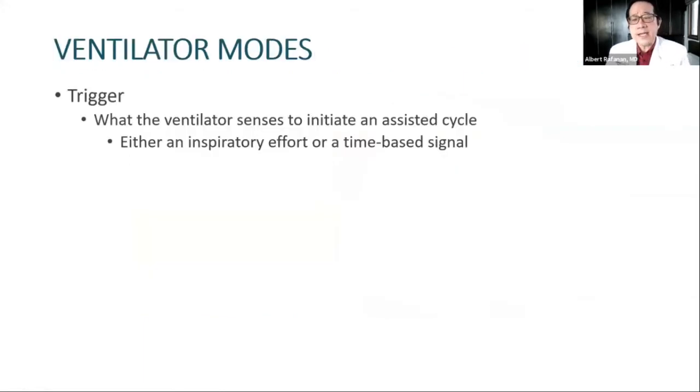In order to better understand what we're really talking about with ventilator modes, we need to understand terminologies. This is very important, and I will try to explain this carefully. Trigger. What does a ventilator sense to initiate an assisted cycle?